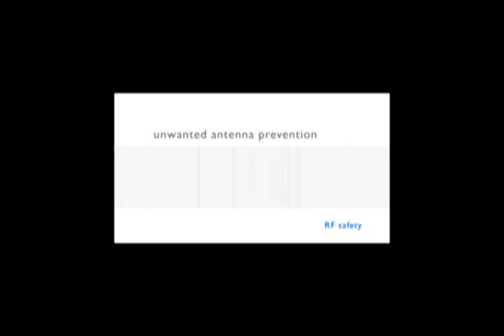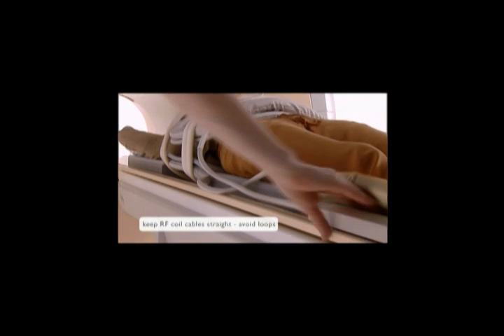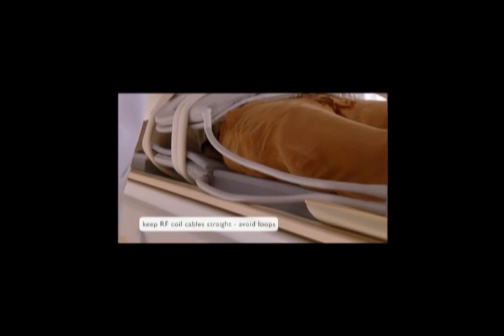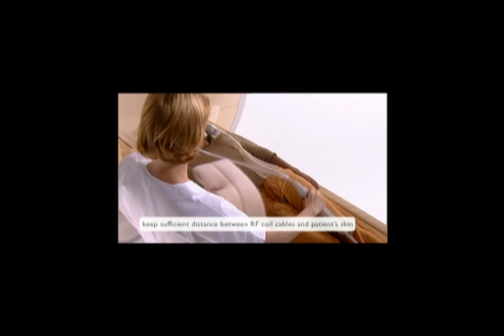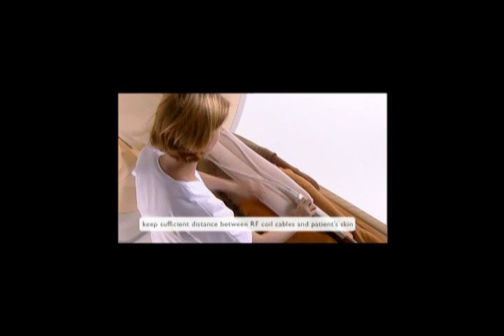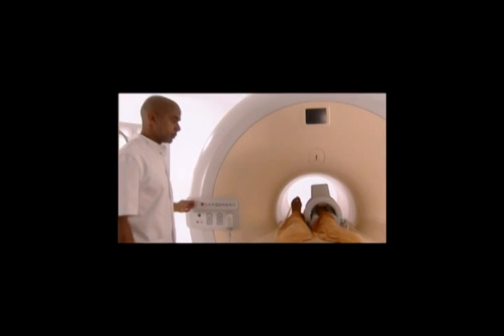Unwanted antenna prevention. Cables should be positioned parallel to the main axis of the patient support. Loops must be avoided, and cables must not cross each other or other electrically conductive objects. There should be a layer of insulation between the patient and the coils. Philips systems are designed to ensure the optimum separation distance. But under some conditions, for example, if the patient's arms are within the scanner, extra padding may be needed.